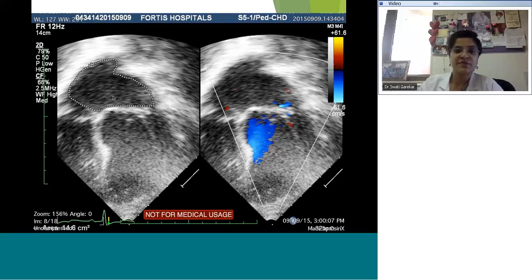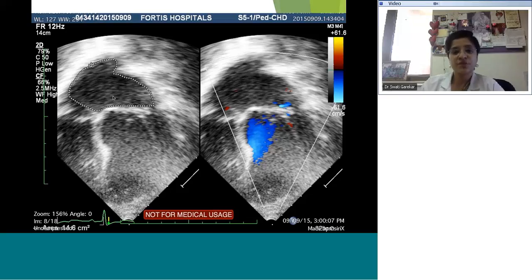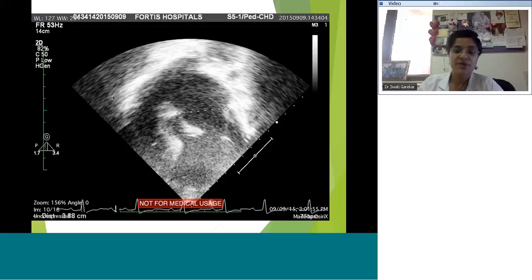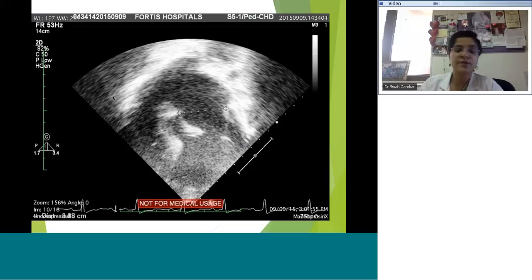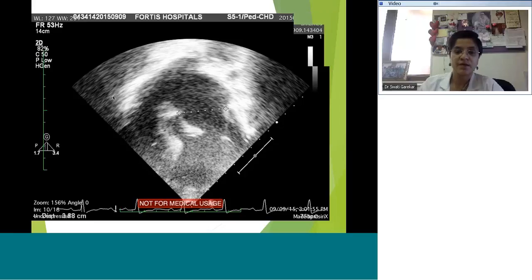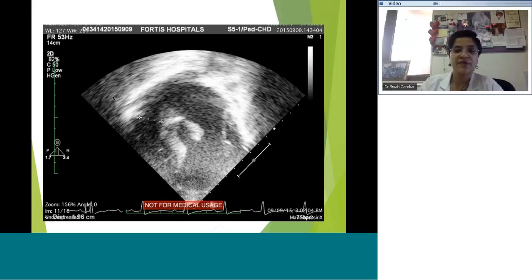Parameters include: one — the vena contracta; two — the jet area with respect to the LA area. It may appear different in different views, so grab the maximum regurgitation possible. Look at the annulus — very important to measure it accurately from hinge point to hinge point — because you'll want to know whether there's annular dilatation. The whole point of the echo is to formulate a management plan: if the patient needs surgery, you should know whether annuloplasty is required along with treatment of a long chord.